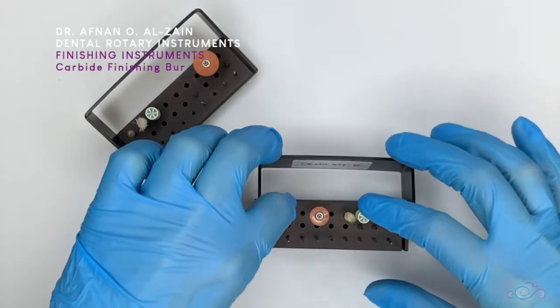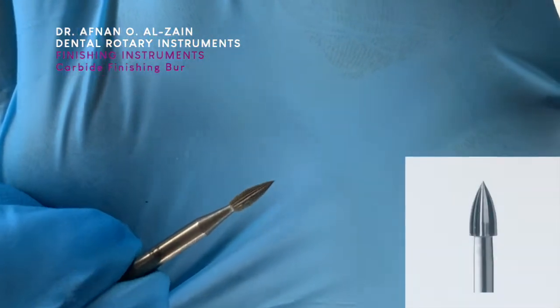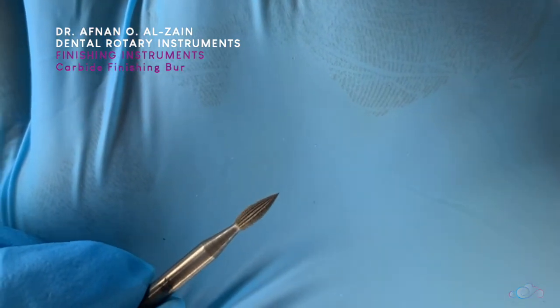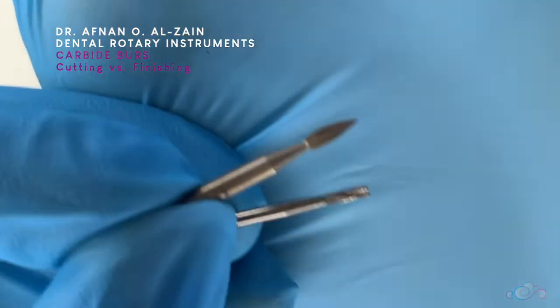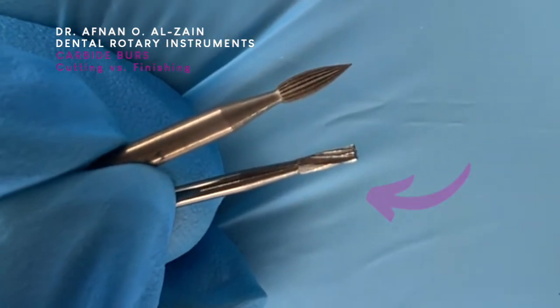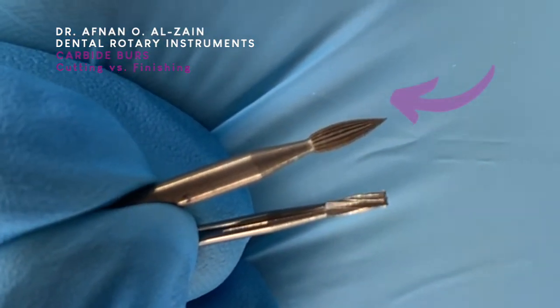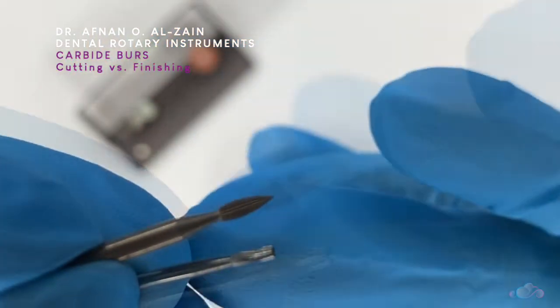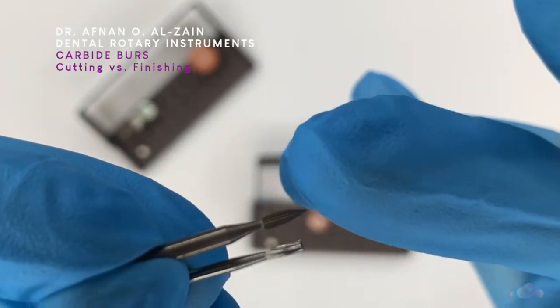Moving on to the carbide finishing burr — we can see that it also has flutes, but there are a lot of them, more than 12 flutes. Comparing the carbide finishing burr with the carbide cutting burr: the cutting burr has more spaces between the flutes, and the finishing burr has less spaces. In cutting, you want to remove tooth structure, so you need space between the flutes to collect it. In finishing, there is less space because you don't want to remove a lot of tooth structure.